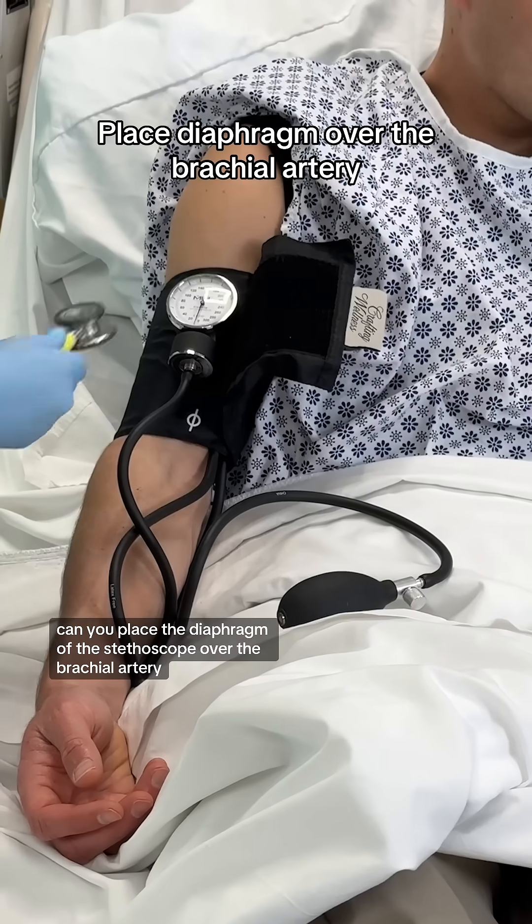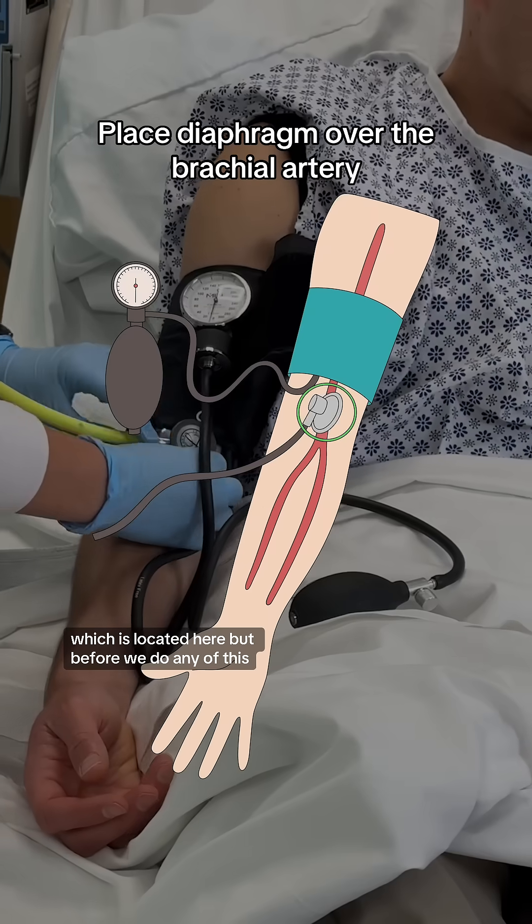Then you place the diaphragm of the stethoscope over the brachial artery, which is located here.